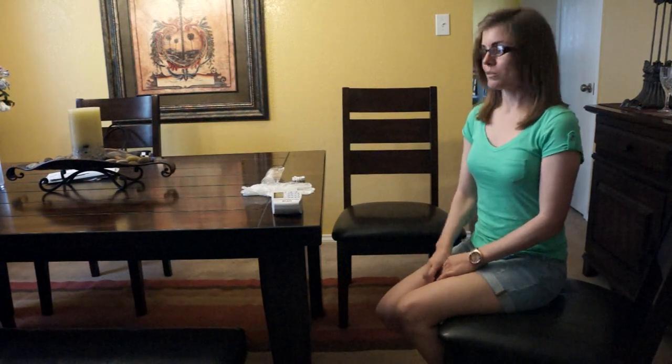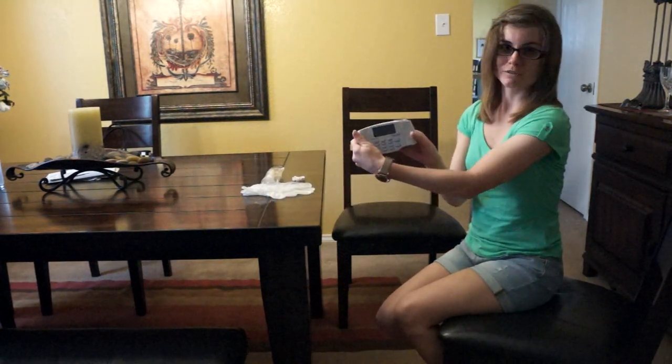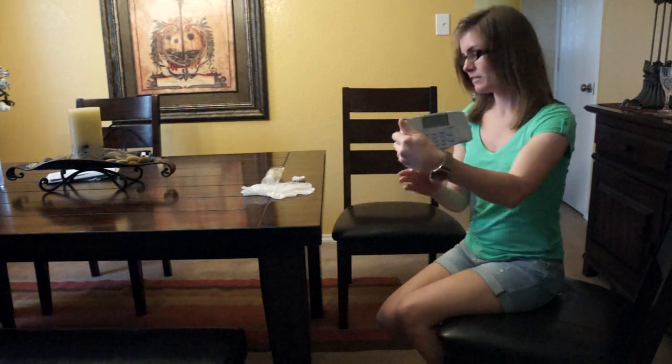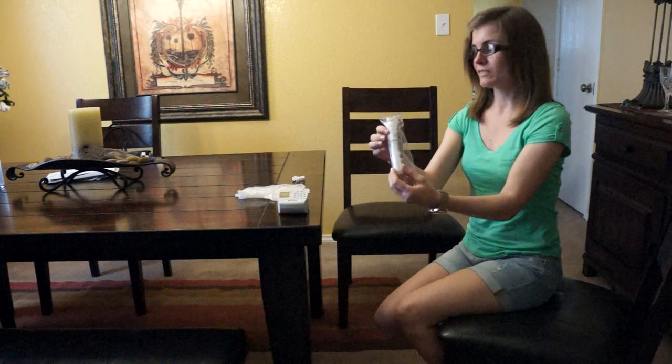Today, all the supplies that you need are, of course, a simple spirometer, just like this one, gloves, a spirette, and nose clips. And of course you need your subject. Subject A, could you please come?